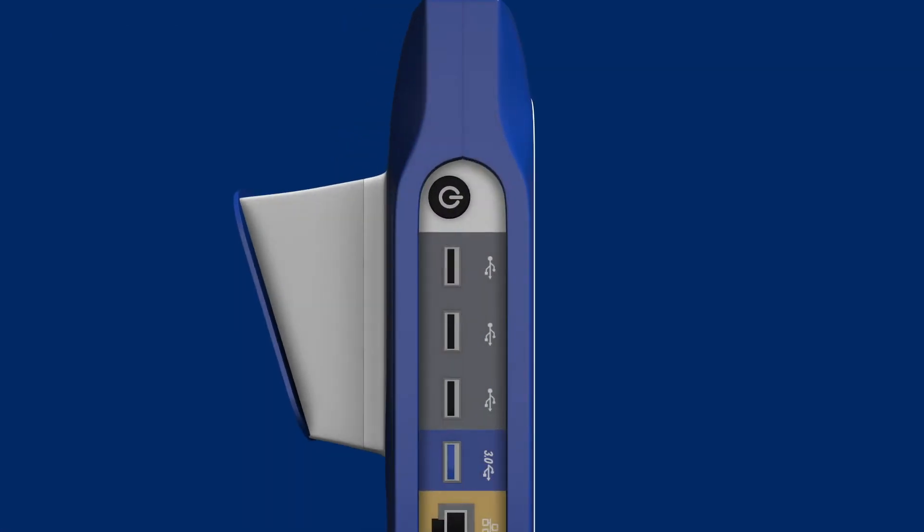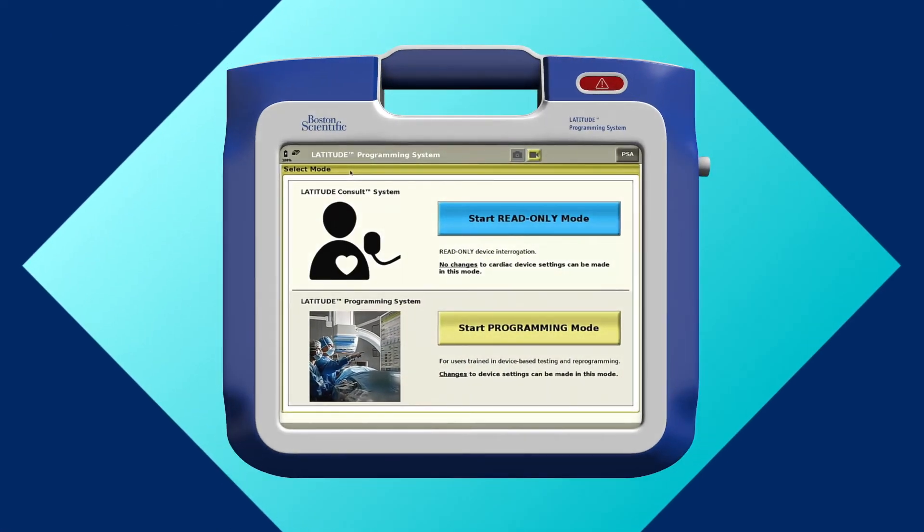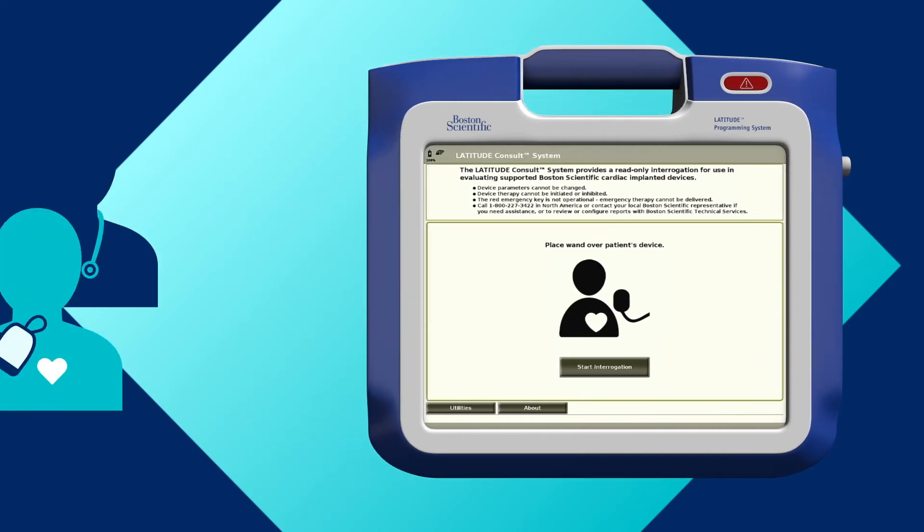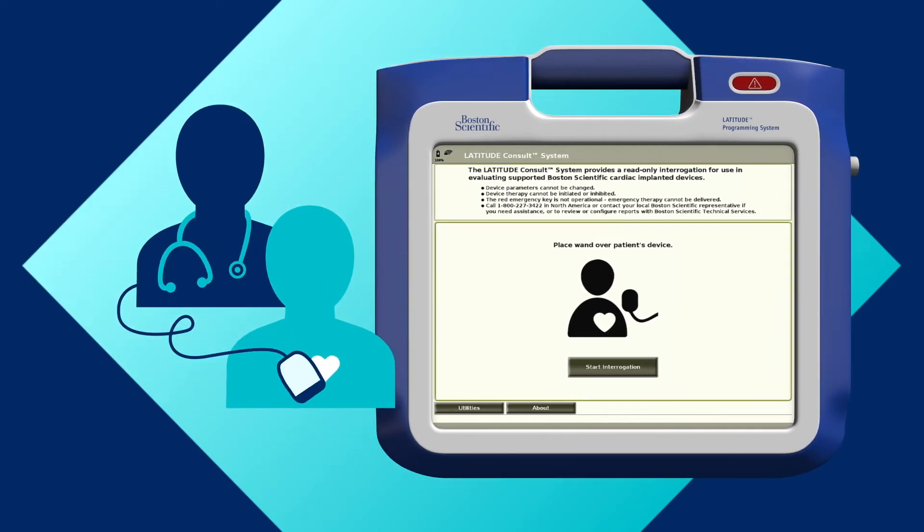Next, power on the system. If you see the select mode screen, press the start read only mode button to access the Latitude Consult application. Then place the telemetry wand over the patient's implanted device.